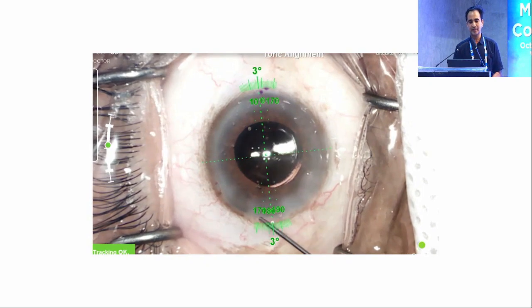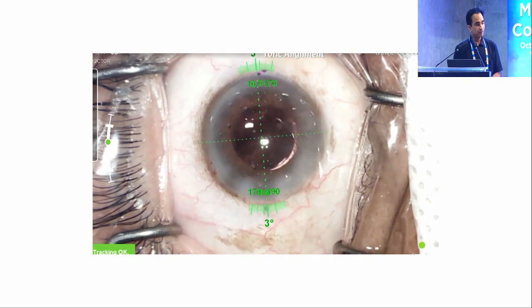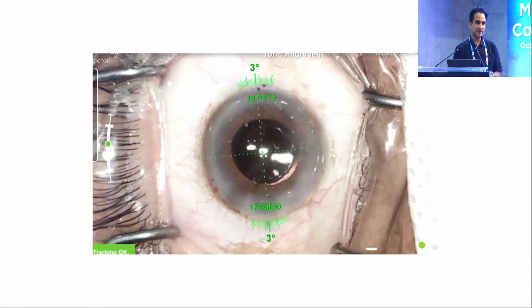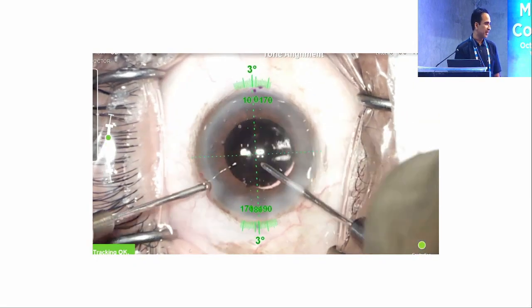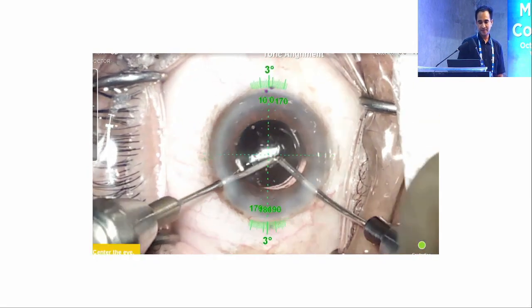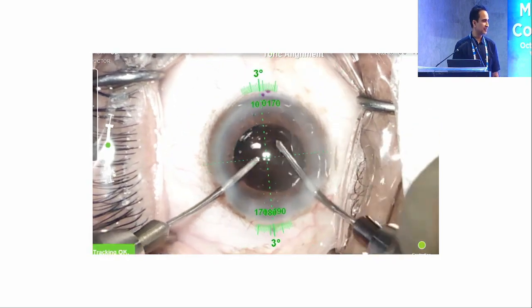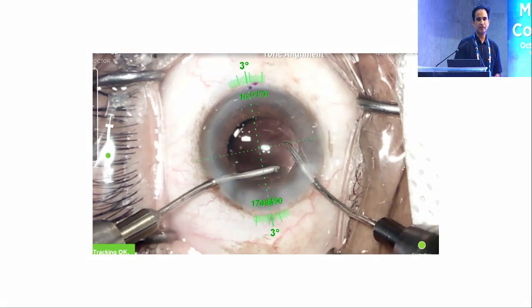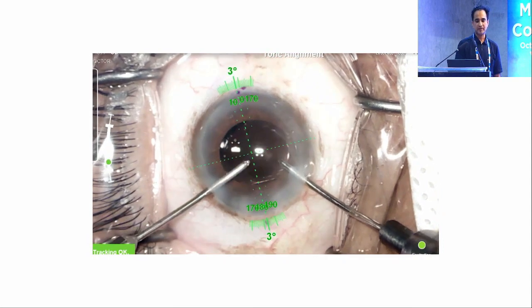One thing is, when we come to the end of the surgery, before keeping it in position, for this lens it's always better to take 1 degree anti-clockwise to the intended axis. Not up to 5 degrees like other lenses, because they don't rotate much. And we have to be very careful while rotating. Don't use excessive force. You might sometimes tear up the capsules.